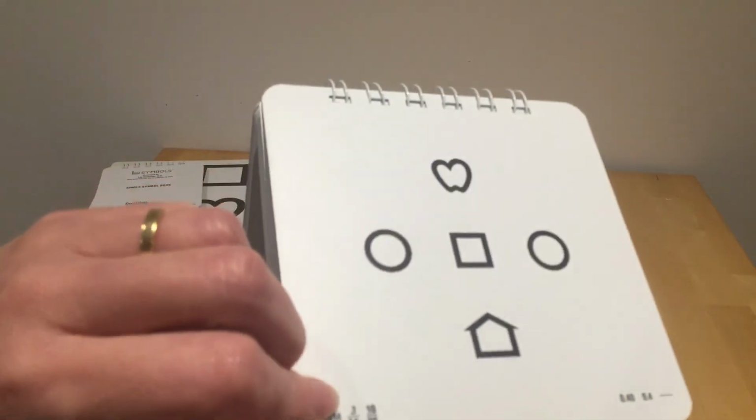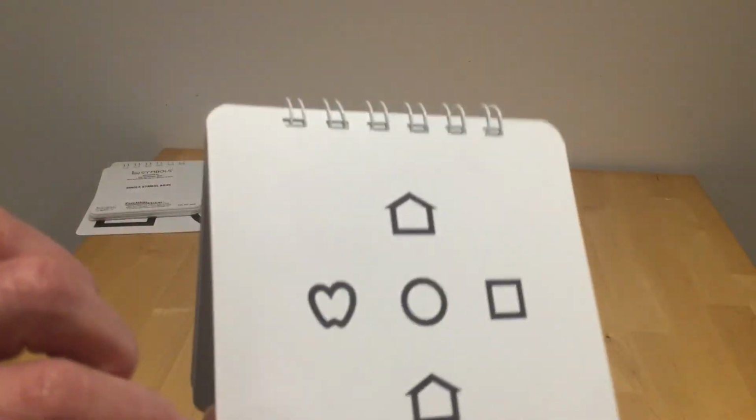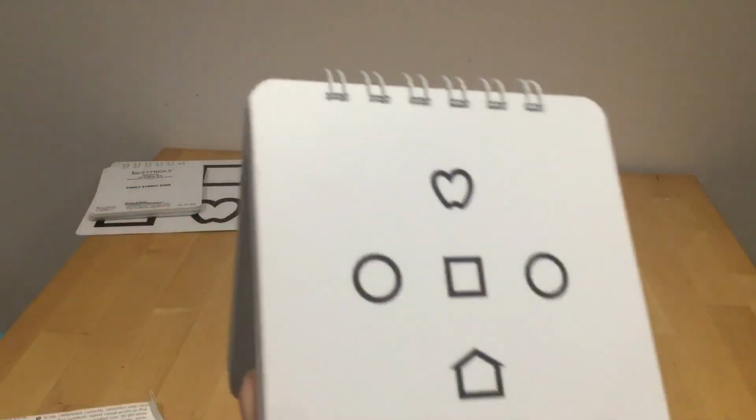Circle. And if they get 3 out of 4, sorry, when you go back, it's not just the one on the outside. You want the heart and the circle. You want the circle and the square.